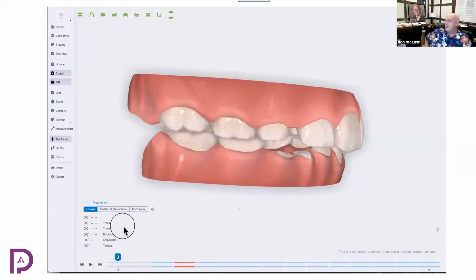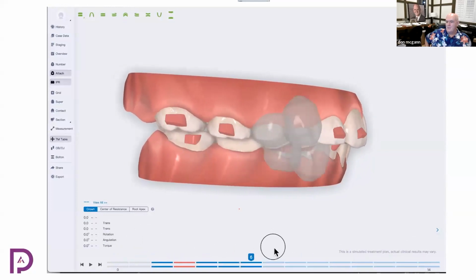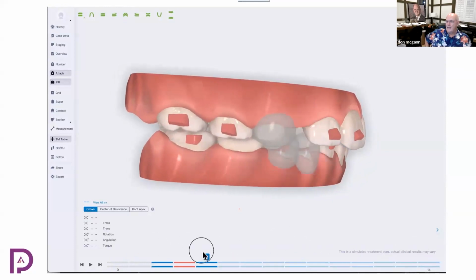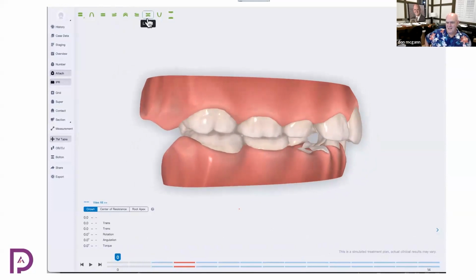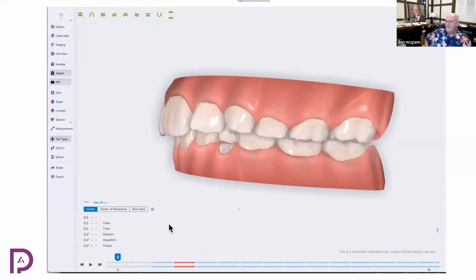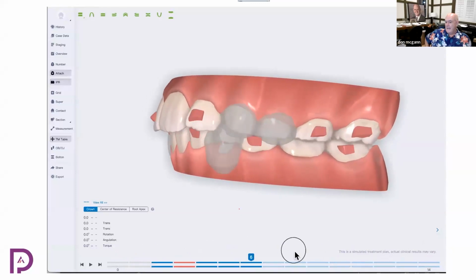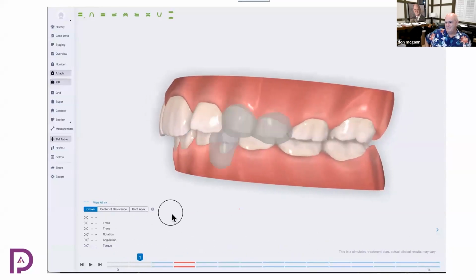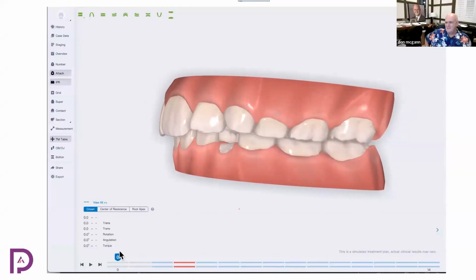So the other way of thinking about it is do it, get it over with, and then make a long retainer. Okay, that they wear just at night. So here you'd want upper and lower aligner retainers, not retainers, aligner retainers. But don't say that word to them either. Just say, give me 12 aligners, and you'll then instruct the patient to change them once a month or just at night after you do this. Okay. Can you see the molar rotation and distalization on the upper?